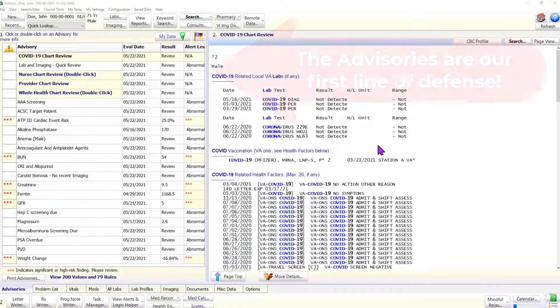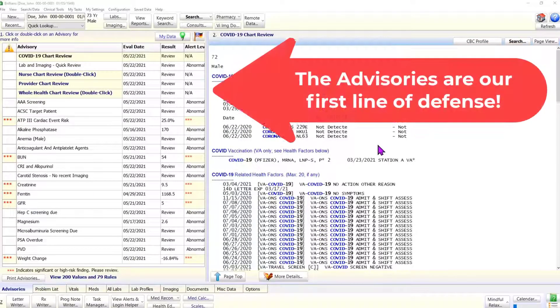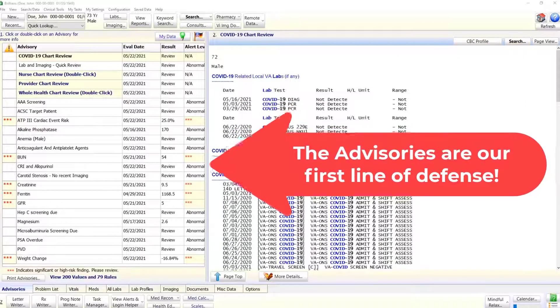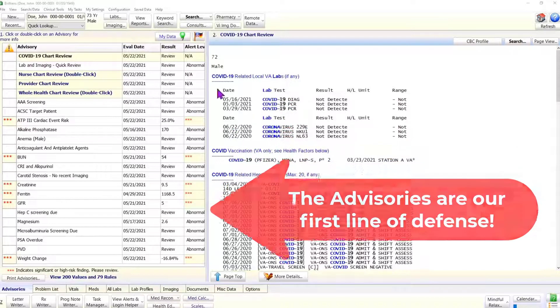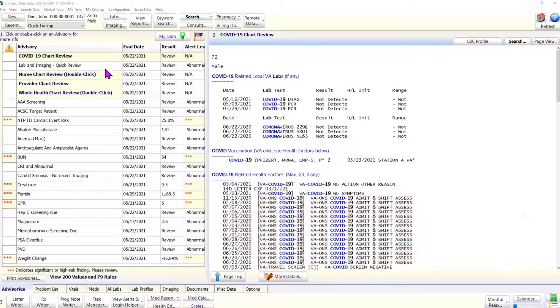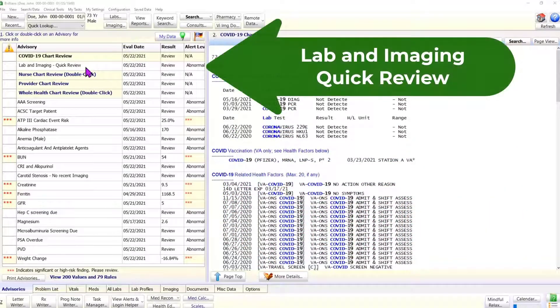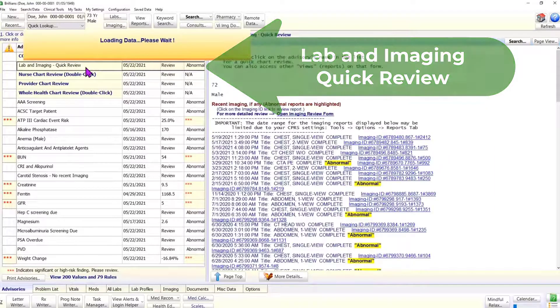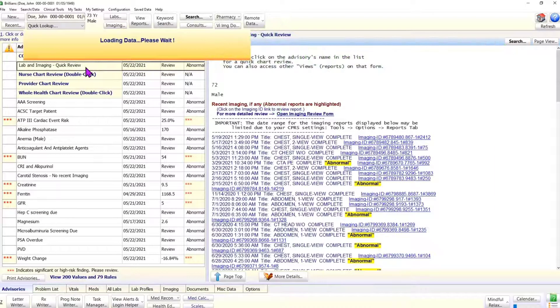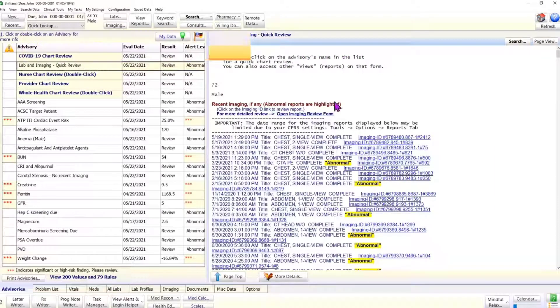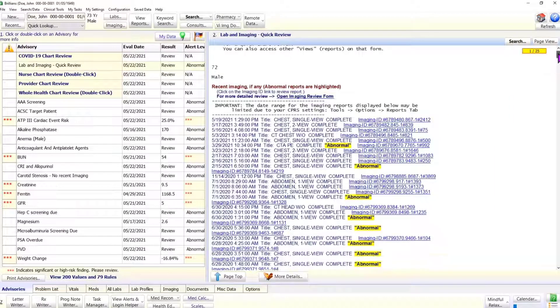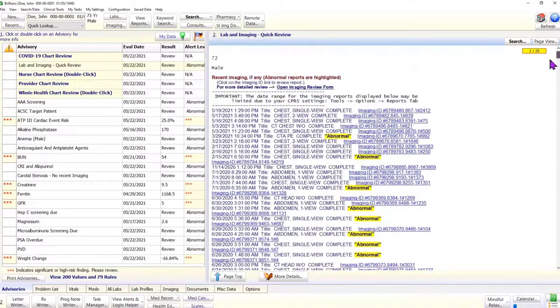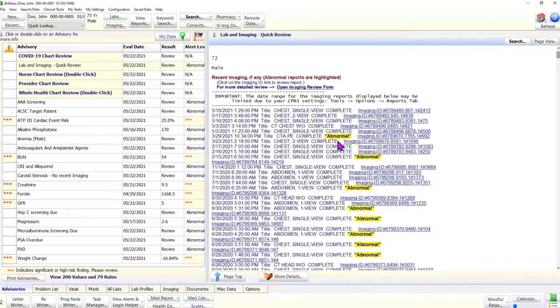In Brilliance, the first line of defense are the advisories. Please click on the advisory name, lab and imaging quick review. This advisory displays the list of recent imaging studies. The reports which are flagged as abnormal by the radiologist are clearly highlighted.